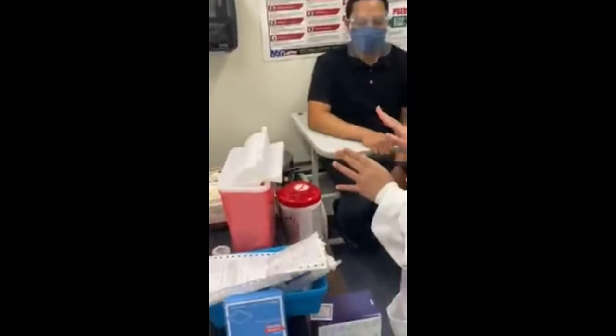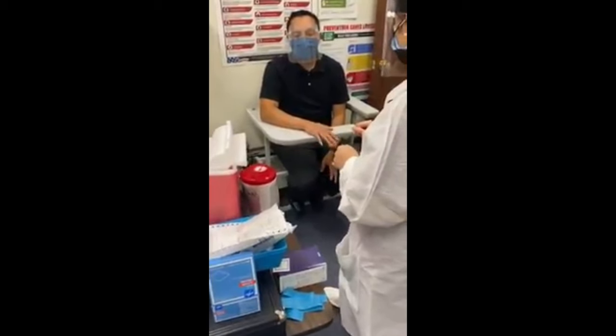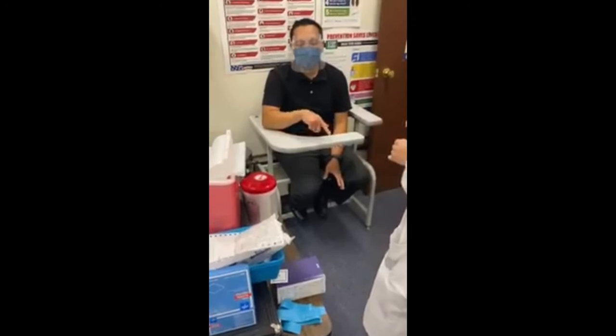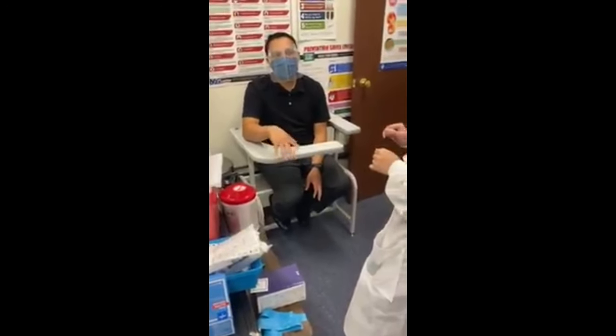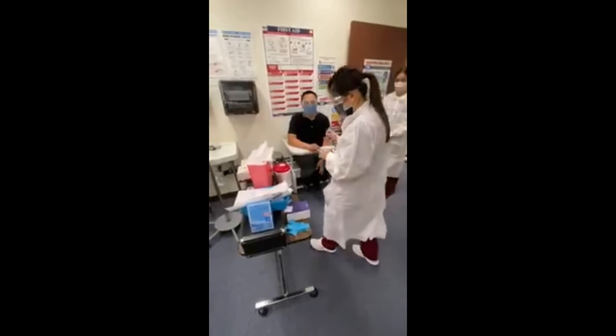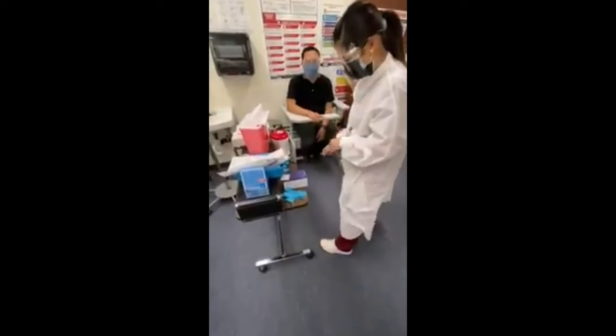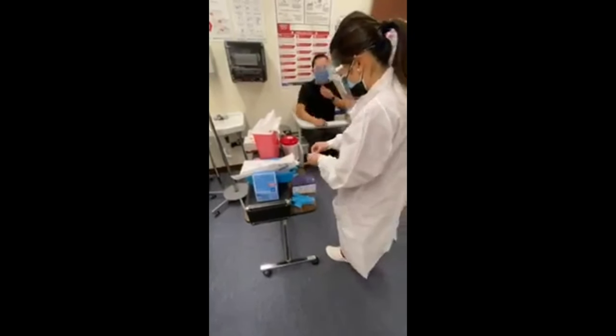Oh, before you prepare, what can you do first, and then you prepare? While you're preparing, it takes time to dry. Okay, let me sanitize your site. Yes. Okay, go ahead and clean the site.